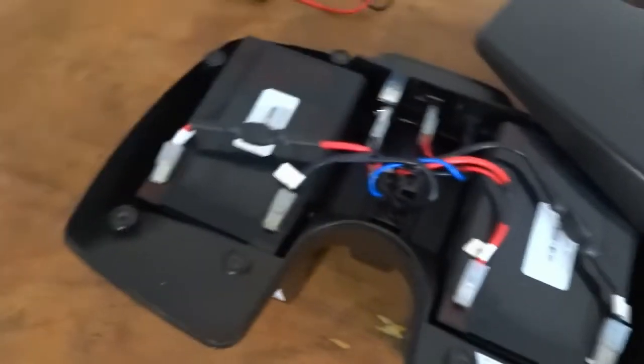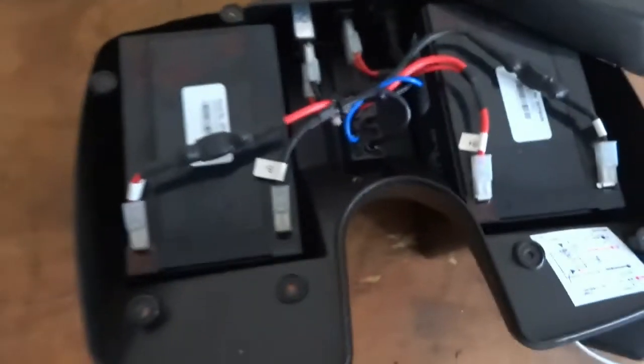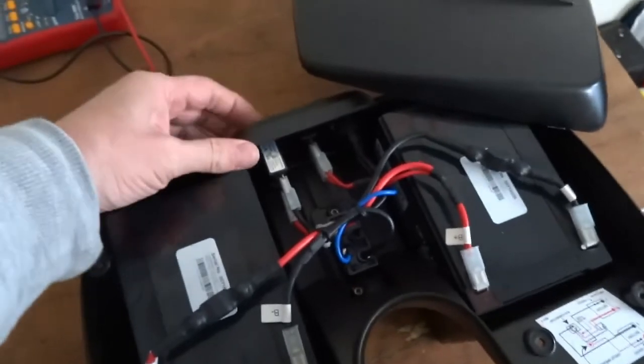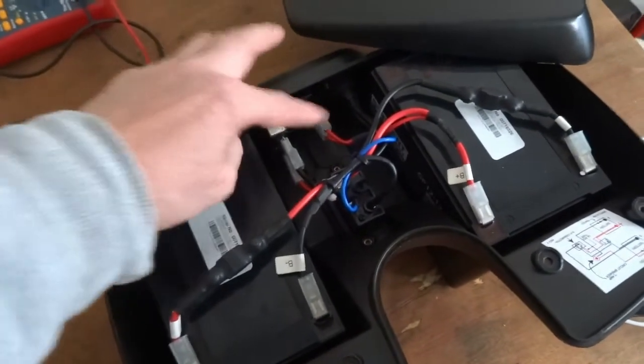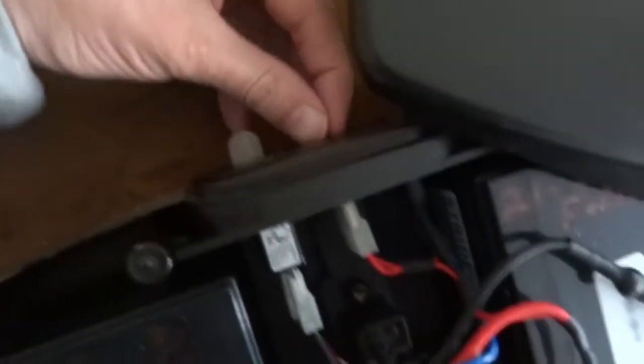So this is the battery pack on this mobility scooter that I'm just working on at the minute. It's obviously two batteries, looks like a resettable fuse and a normal blade type fuse there that fits in the front end.